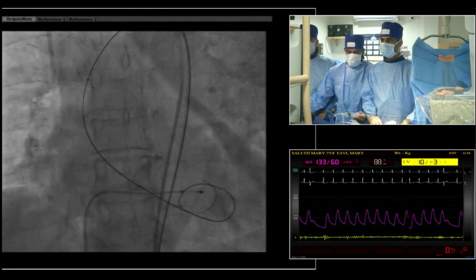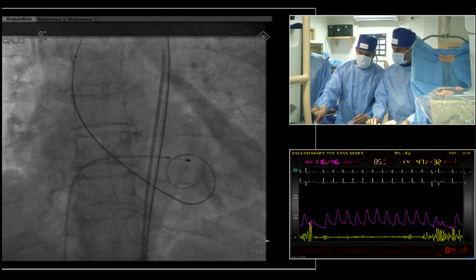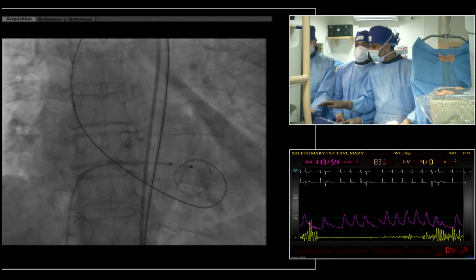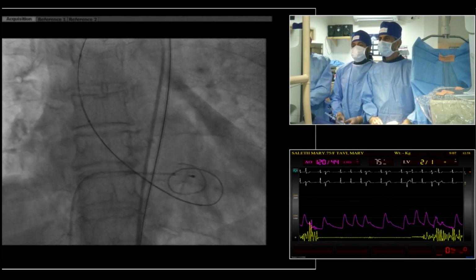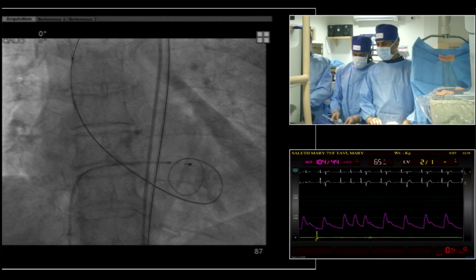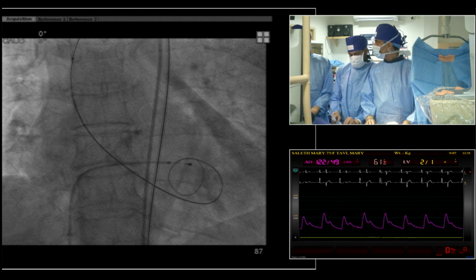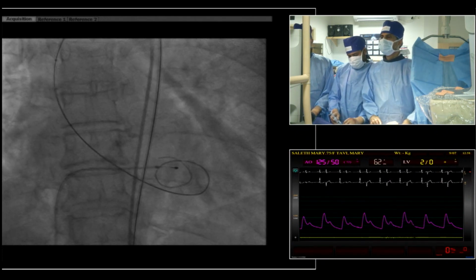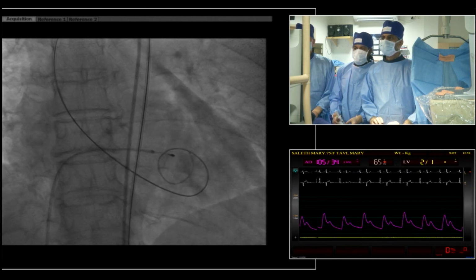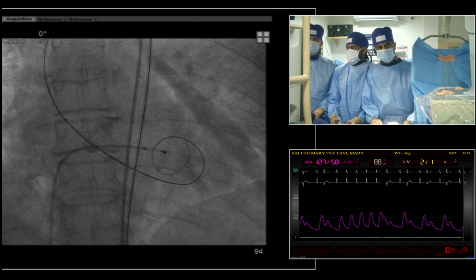So Contero, this is the time to go over the CT. What are the important numbers that we note on a CT? There are numerous numbers out there which can make everybody confused. So I think it's a good thing to discuss what are the important numbers that we look at which change our strategy and selection of hardware. That's a really important point. And for me, it's really important to find the smallest part of the aortic valve complex.